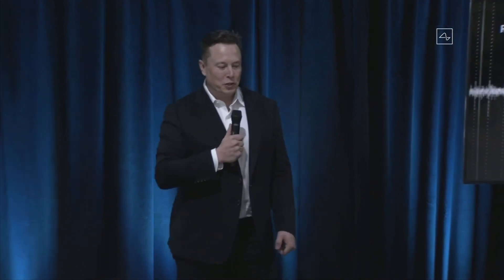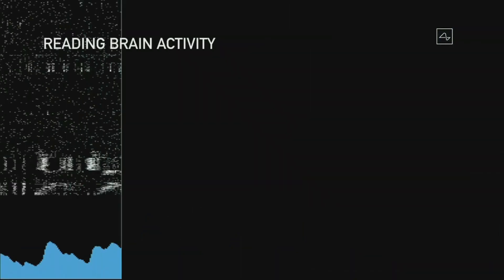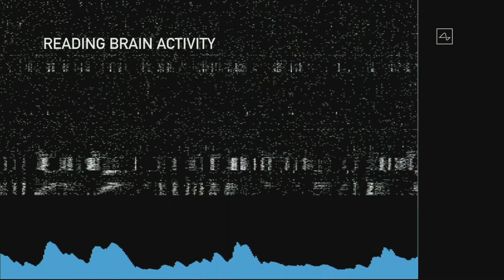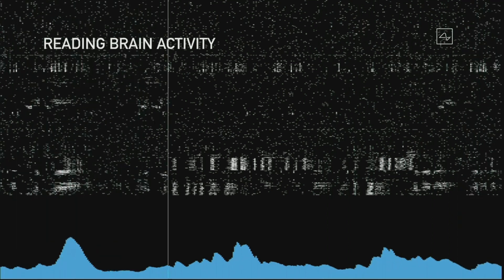We just showed you a demonstration of reading brain activity. Each of those dots represents a neural spike, and the blue chart at the bottom is showing an accumulation of neural spikes in that region.